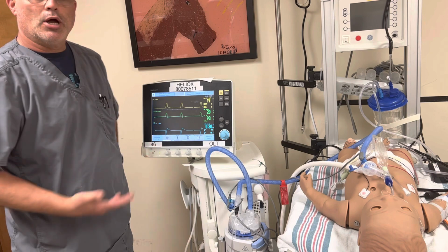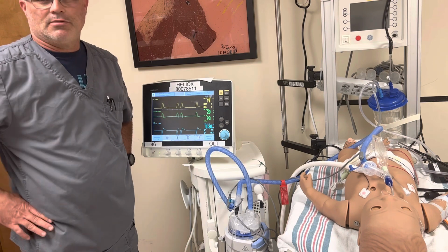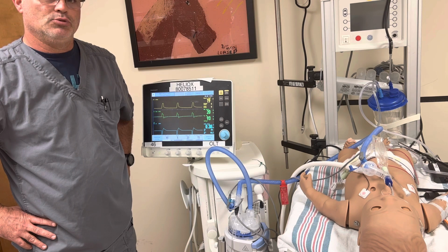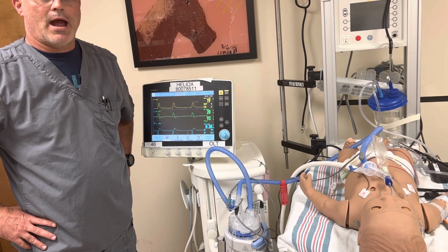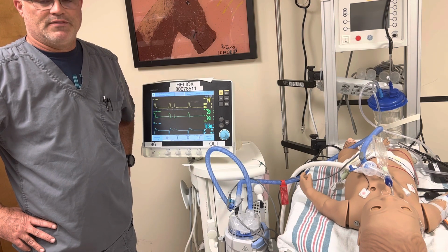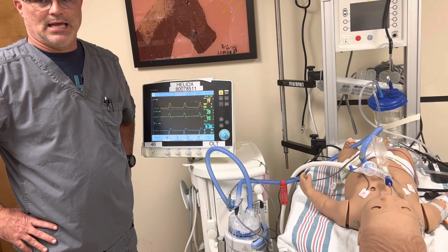But in different modes they have also settings that affect patients' ventilatory status that don't have to be specifically ordered. Now they can be ordered anytime a physician wants to dictate that specific setting needs to be something, and it doesn't fit what our practice or our policy or guidelines are for setting it. But what we're going to do is go through our most common setup, where the physician only orders those needed orders and everything else is left up to our algorithm and guidelines and policies to set them.